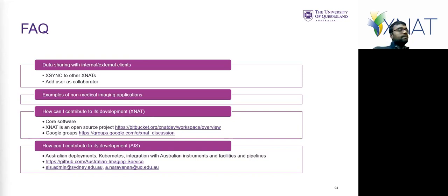What if you have a project, you've shared it with other sites that can all log in with AAF, and you want to share it with your overseas collaborator? Can you request an AAF login for them in the same way that we do for our own? Yeah, they just go through the same application process. It shouldn't be an issue. We just use AAF and stop there. There was a question about examples of non-medical imaging applications, and I'm not too familiar.